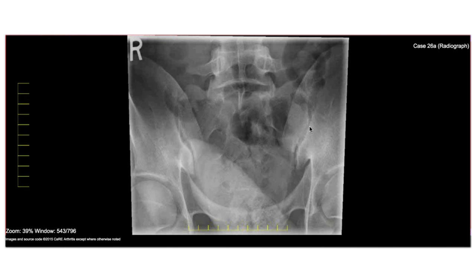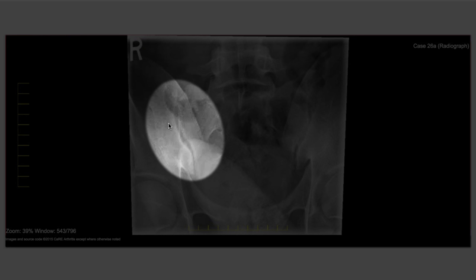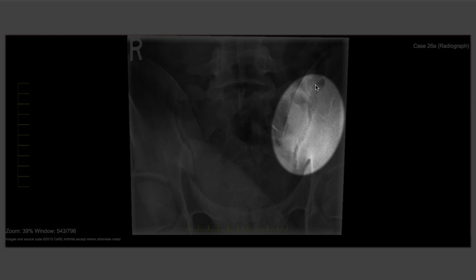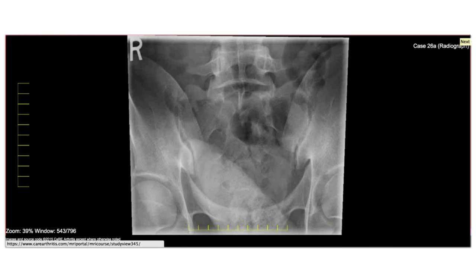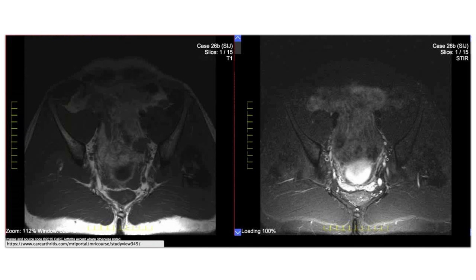This is his X-ray. On the right side he has nice clean margins to his joint. On the left side, it looks like there might be some irregularity, but there's a problem — what you see are shadows from gas in the bowel. Bowel sits in the pelvis and often overlaps the sacroiliac joints, and it can really cause problems with interpretation. So this X-ray was actually difficult to interpret because of an overlying gas shadow, and not surprisingly was reported as normal. Let's have a look at what his MRI shows.